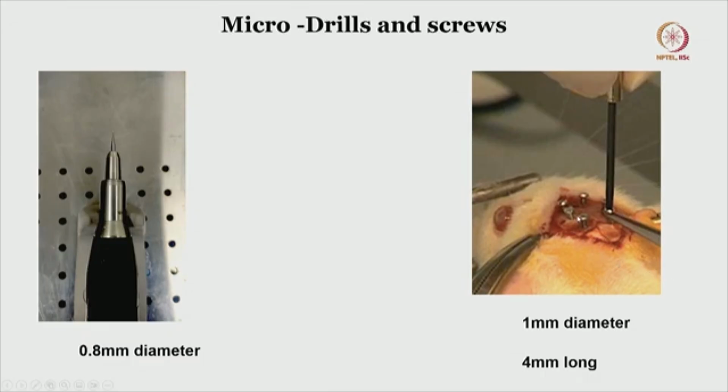We are going to use similar screws as we discussed in craniotomy as well, wherein this is going to give a very good rigid fixation, where the implant as well as the screws become a big blob of acrylic dental cement, and it is all fused together to give a good rigid fixation of your primary implant. So, it is very important to practice this as well.